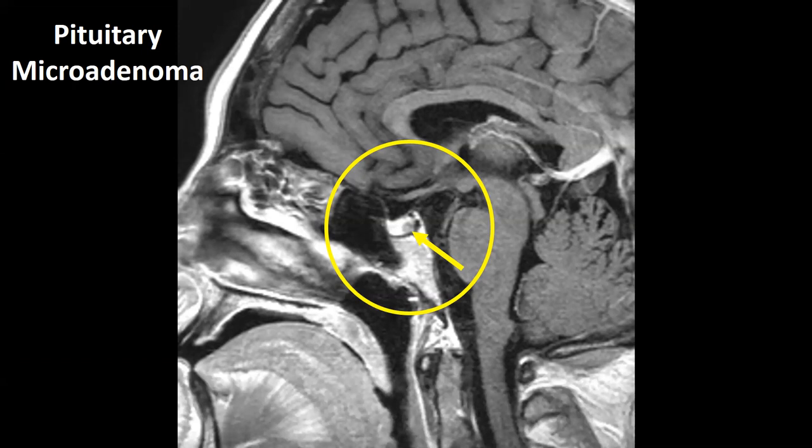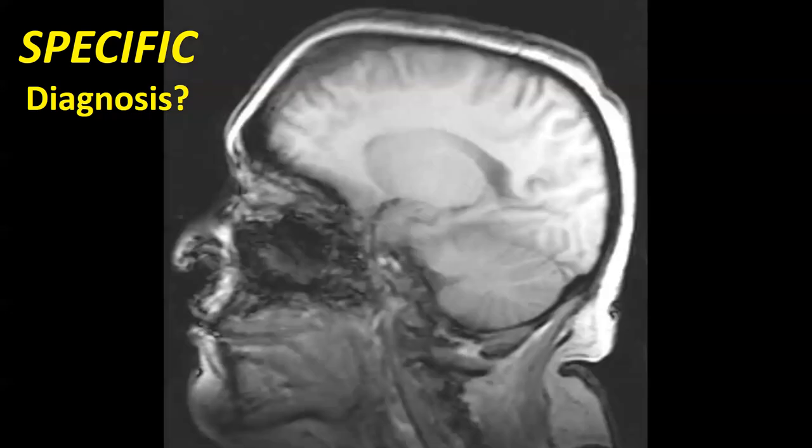It's a pituitary microadenoma. I want to know a more specific diagnosis. I'm going to show you another MR image, okay? Within the context of what I'm asking, I want you to tell me what type of microadenoma it is, and you're going to have to justify it. Okay, you ready? Now, the adenoma, of course, is not visible in this section. I'm sure I don't even have to say that. What type is it and why?